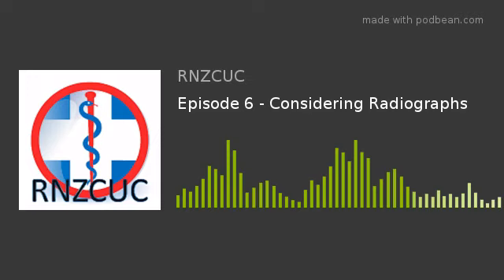Because if we were to take the picture with the mouth closed, you'd get all of the teeth overlying the top of your C1, C2 joint, which is what you're trying to see, so it's not very helpful. By opening the mouth, you're able to completely visualize that joint through the opening in the mouth as the teeth are completely out of the way.